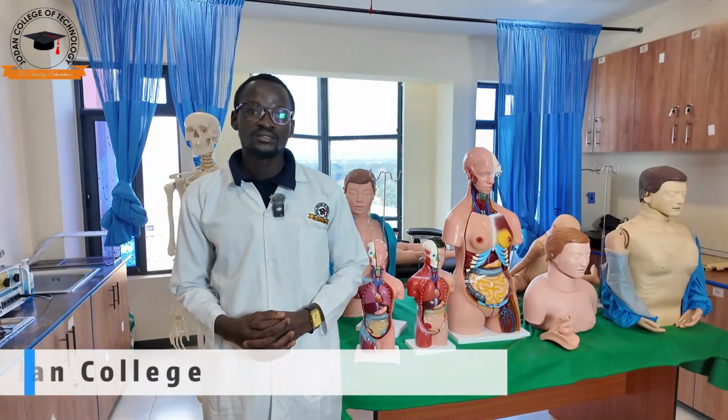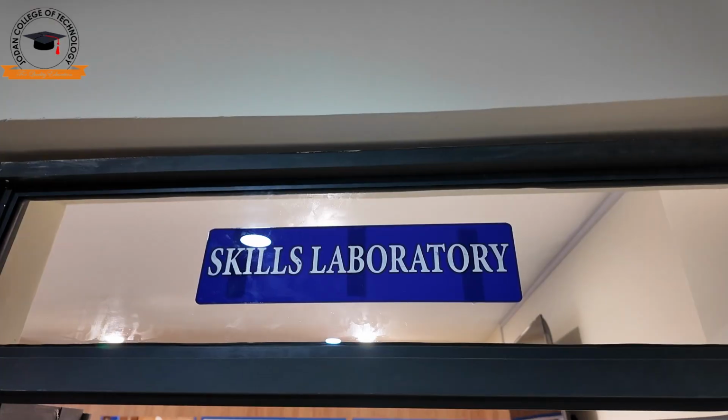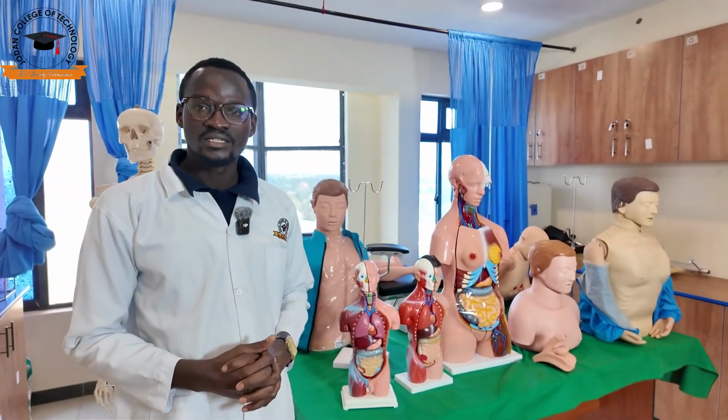My name is Edwin Okot Ochieng. I am a medical trainer, Jodan College of Technology. So this is our skills lab. I'm here to show you various models we normally use to train our medical students.